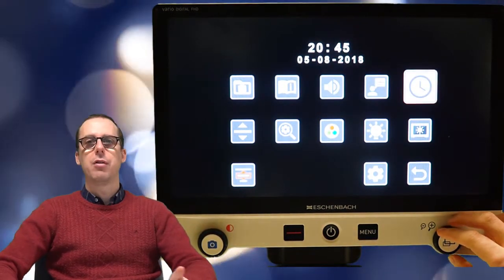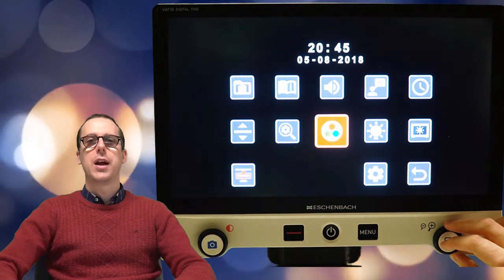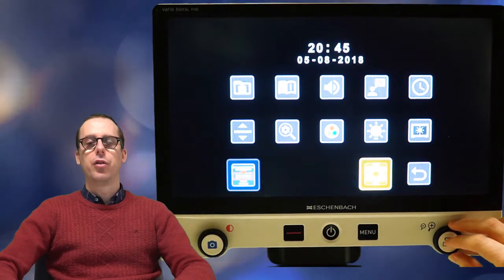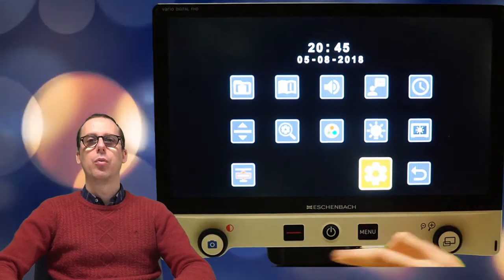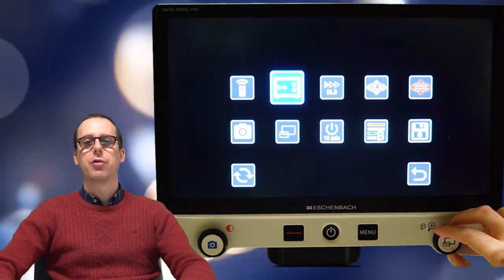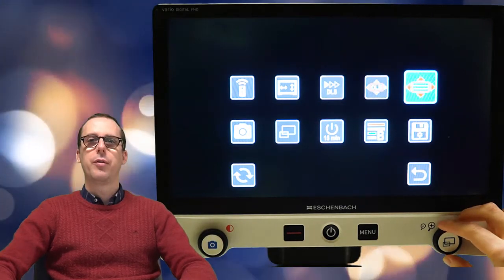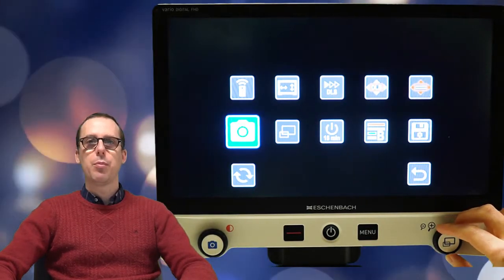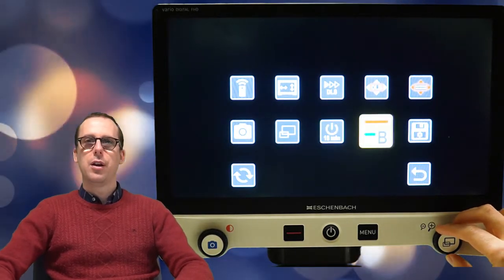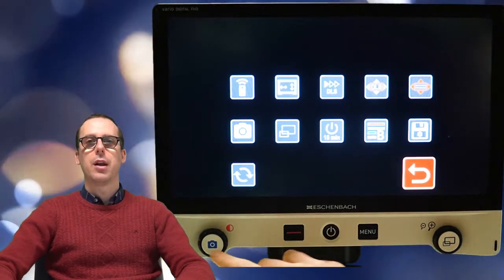As I said before, the gallery is there for your saved pictures. You can change screen brightness. You can change whether the lights of the device are on and off, and all those types of things. You can also disable certain functions if you don't want them to be available, such as the scrolling, which is called dynamic line scrolling. And there's also some things in there which are kind of interesting, like a blue light filter. So if you have trouble going to sleep because you're using your magnifier late into the night and all of that white light is messing with your circadian rhythm, then you can turn on the blue light filter to help with that. And I actually find it quite relaxing on the eyes.